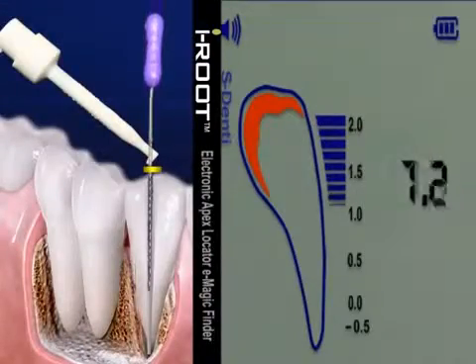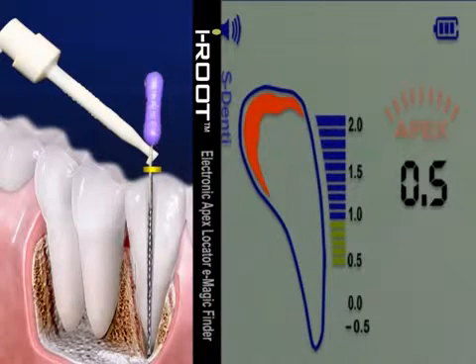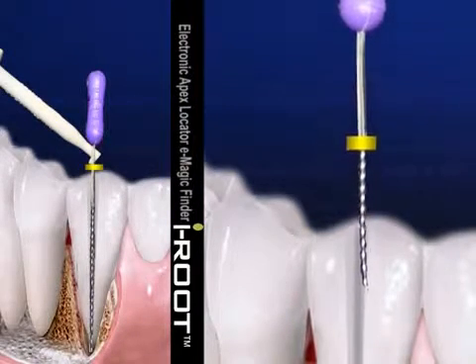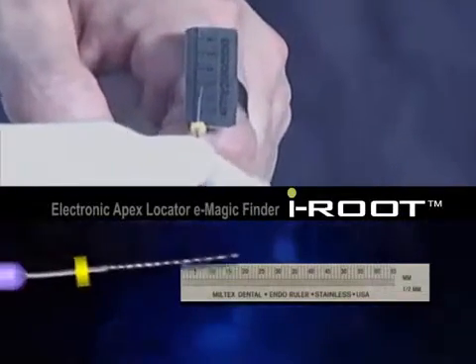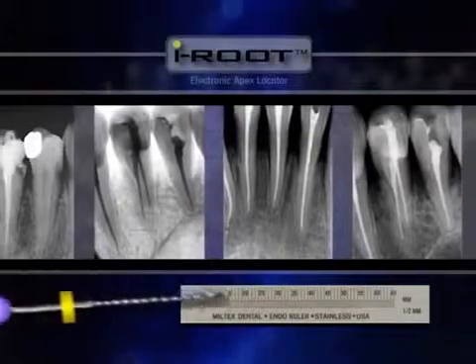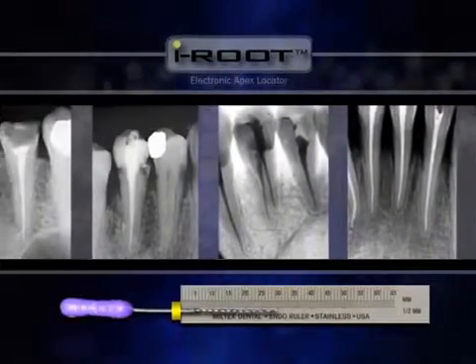When it reaches .5, the word APEX in red letters on the screen flashes and the beep becomes strongest. Move the rubber marker as close as possible to the root canal's entrance and slowly take out the file. Use a dental scale as needed to measure the length from the rubber marker to the file's tip — this is called the working length. It is highly recommended that you take an X-ray to check the measurement.